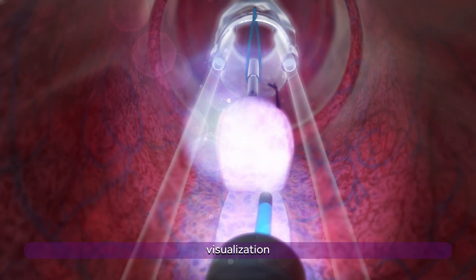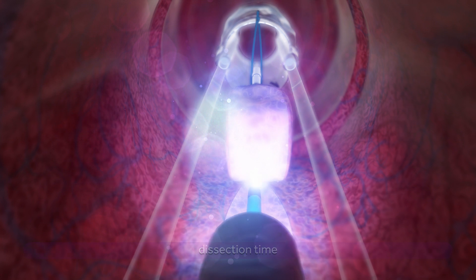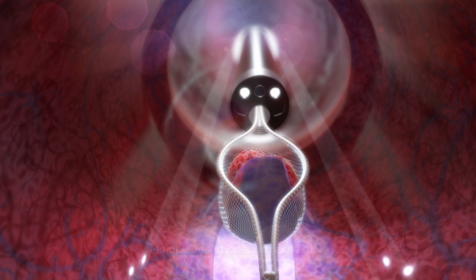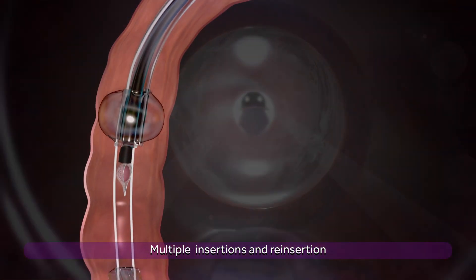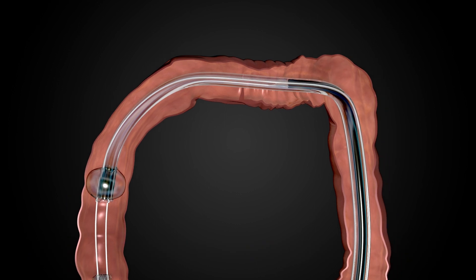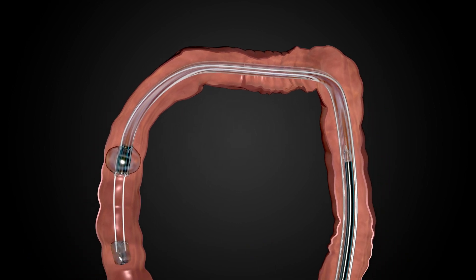The DR dynamic retraction system is unique to DiLumen and may improve visualization and dissection time. Finally, the polyp and endoscope can be removed while DiLumen remains in position. Multiple insertions can occur throughout the procedure without losing position or having to spend valuable time navigating back to the therapeutic site.